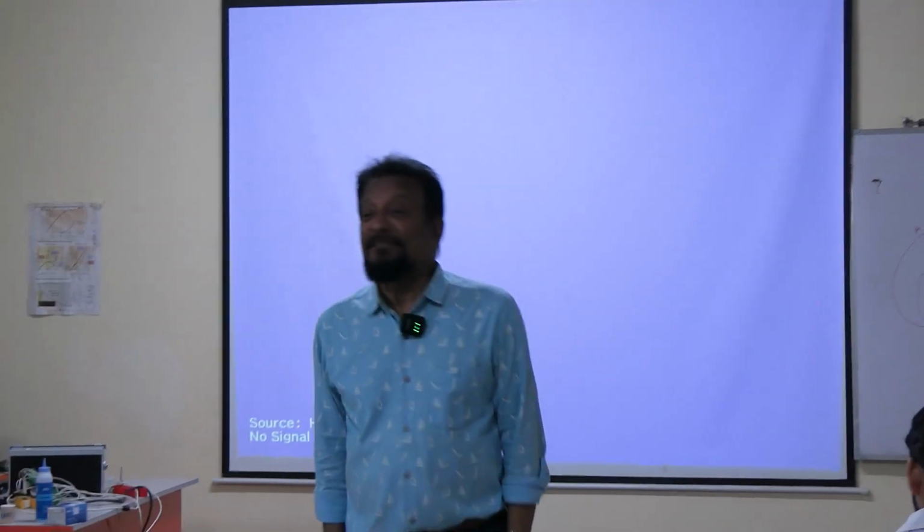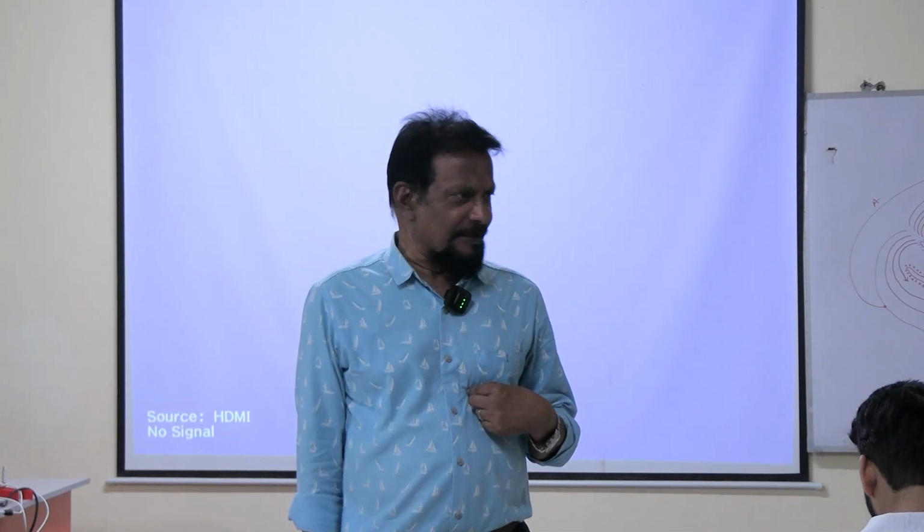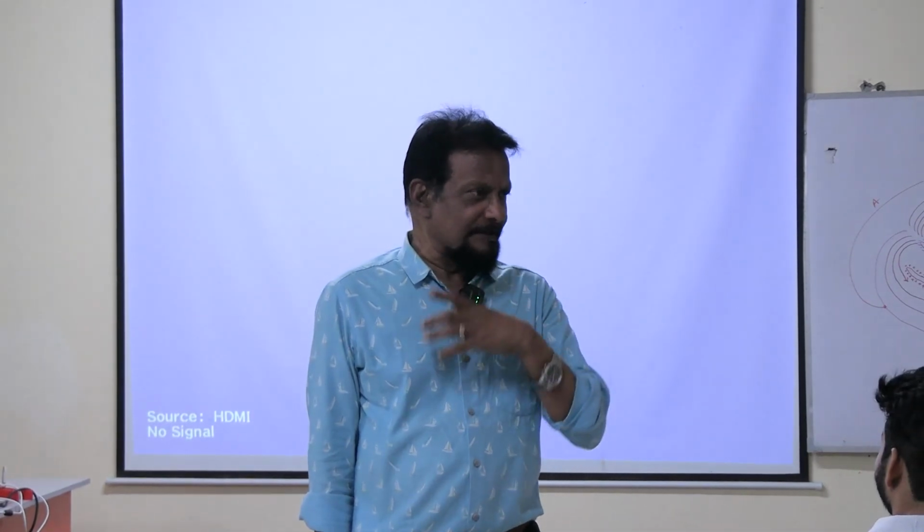Who will tell the position of V4? This is the location. So should I tell about the location of lead V3? I also forgot. Let us do some adjustment. We know where V4 is and where V2 is.